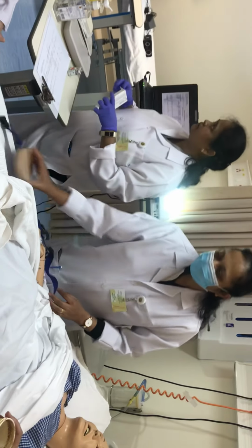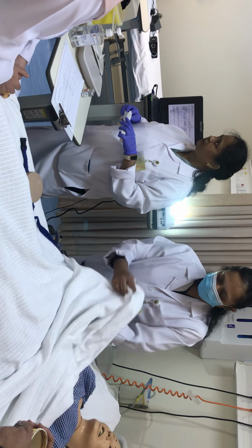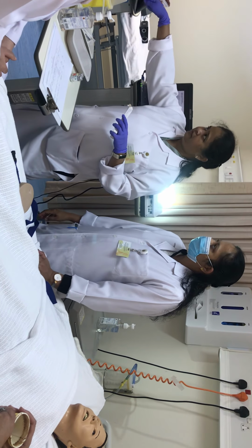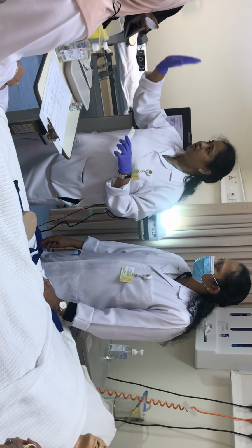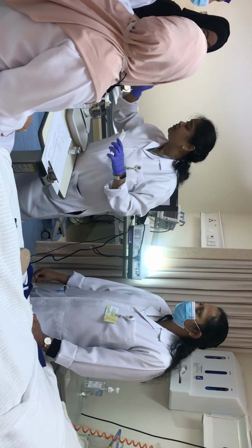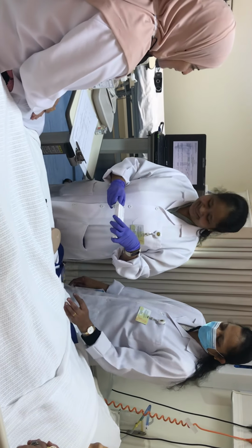For the sharps, they're saying that the companies or hospitals take it by weight and they're paying a lot of money. And they say to throw only the needle, not the full syringe. We cannot detach this one. When we come to IM, I will show you how. See, these areas are all for detaching the needle separately. But it's not easy during the exam for the students. So we allow them to throw it even if they don't detach. We teach them how to unscrew it and throw also. But if they do not know, let them not waste time on that. No problem, let them. Unless they do the procedure well, it is allowed.